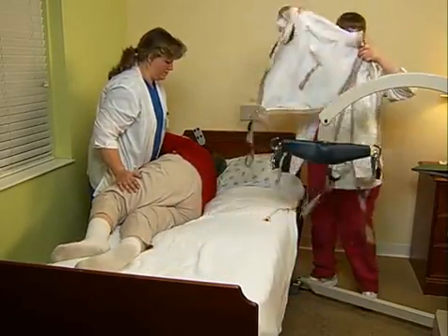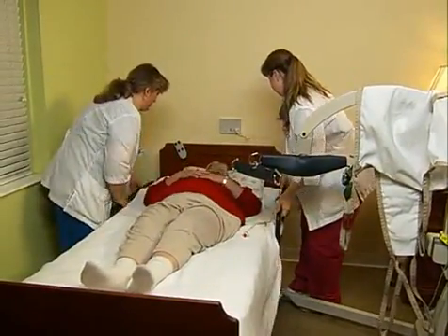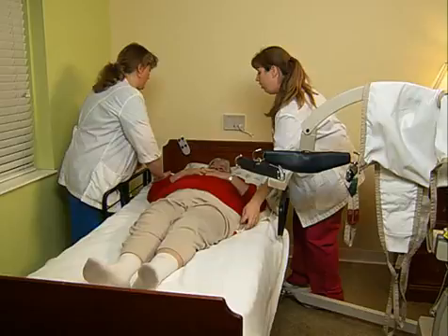With any method, compare the patient's current height and weight with previous measurements as part of your follow-up care. Perform hand hygiene and report completion of the procedure and your observations to the charge nurse. See the follow-up section of this program for detailed information.